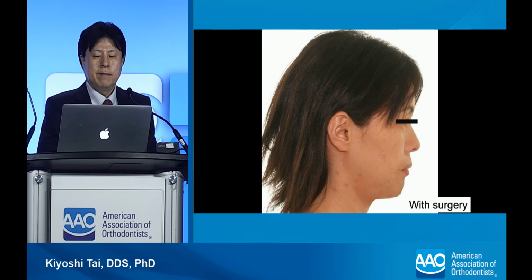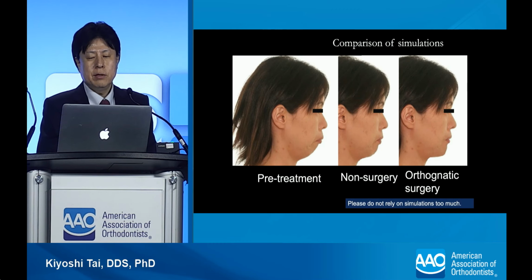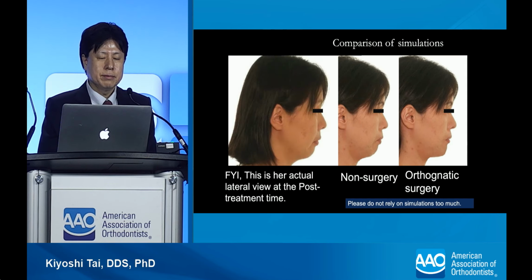This is the VTO of the surgery case. This slide shows the comparison between the simulation of the camouflage treatment and orthognathic surgery. This is her actual lateral view. Please compare it with the simulation images. However, please do not rely on the simulation too much.